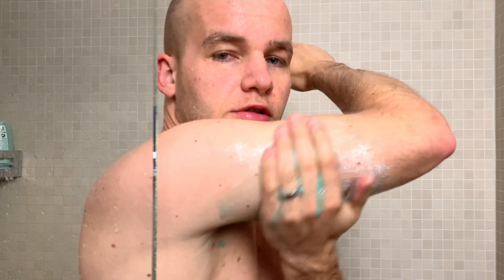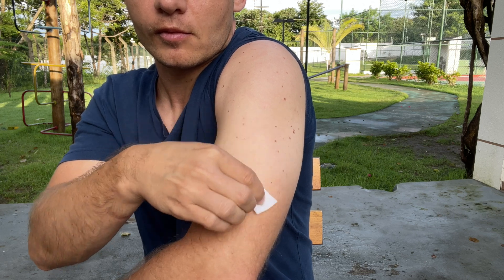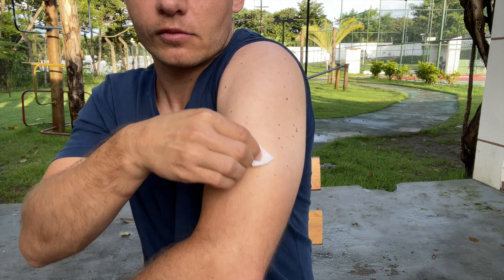Feel free to pause this video here and take a few seconds to look at those screens closer. Next, the app will ask you to apply the sensor. Wash your upper arm with plain soap, dry it, and then clean the spot where you want to place your sensor with an alcohol wipe.